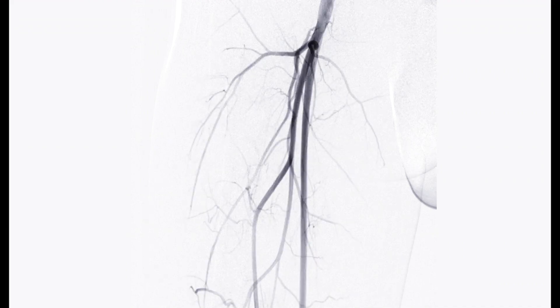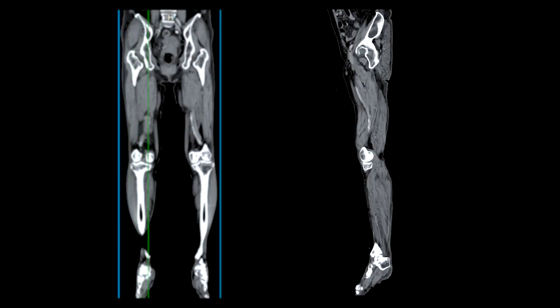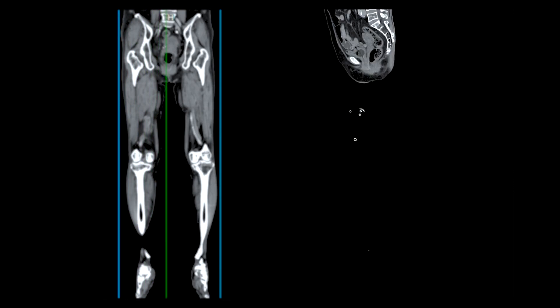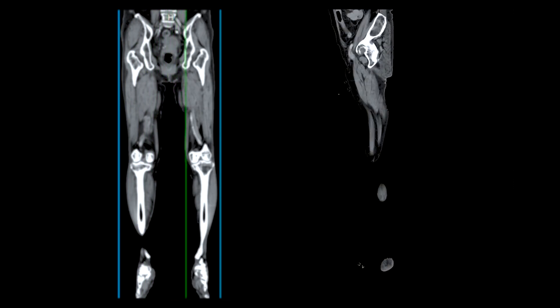The procedure starts with an angiogram, which involves injecting a special dye into the blood vessels of the affected area. This dye makes the blood vessels visible on x-ray images, allowing the doctor to see any blockages, narrowing, or other abnormalities.